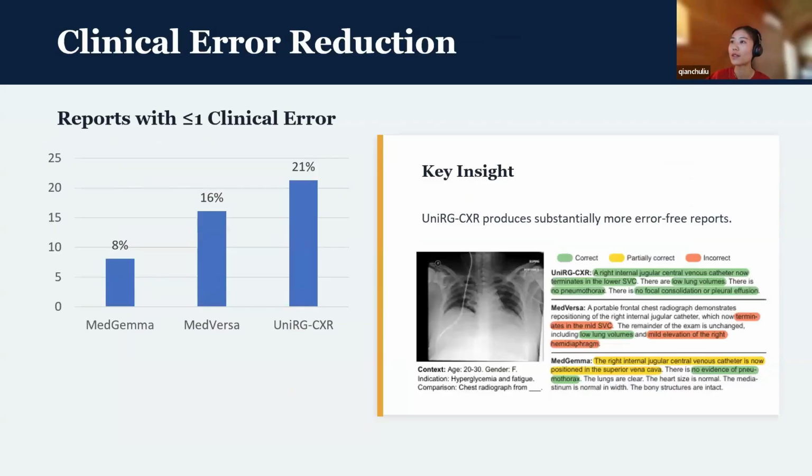Yep, and then on the next slide, I also want to show you, in a more straightforward way, the error reduction for the model. Here I have shown the percentage of reports that have close to zero clinical errors, which could already be very useful for the radiologist.